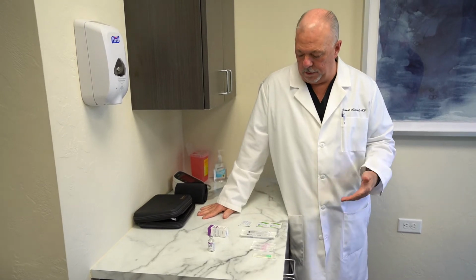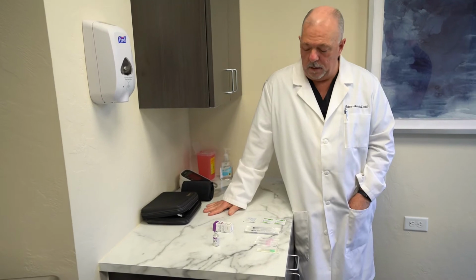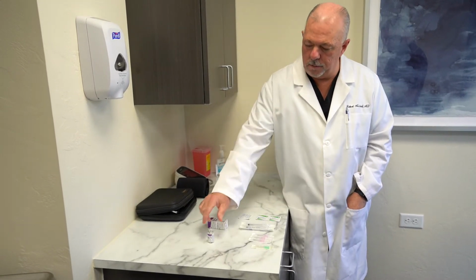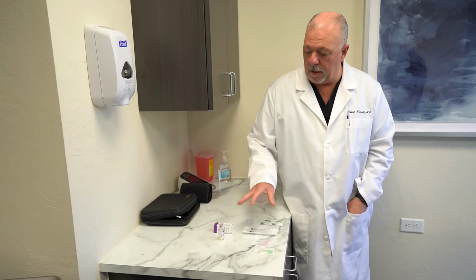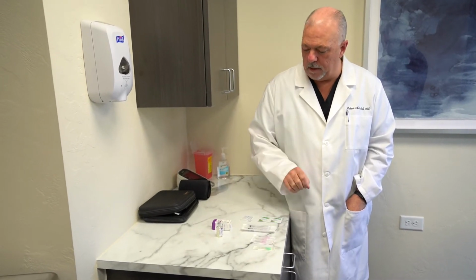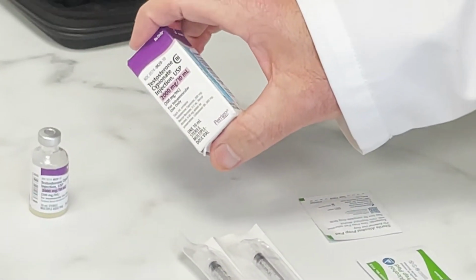Today we're going to demonstrate how to prepare an intramuscular injection. This is an intramuscular testosterone injection. In your order, you should have received a box with medical supplies for injection, alcohol swabs, and a vial of testosterone.